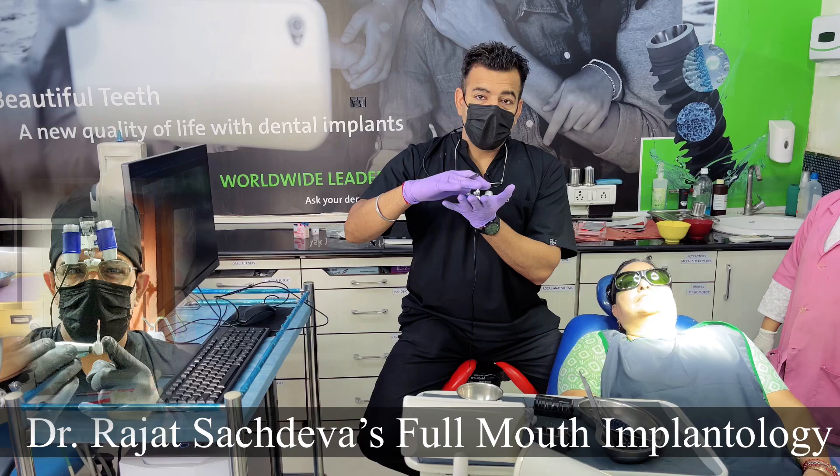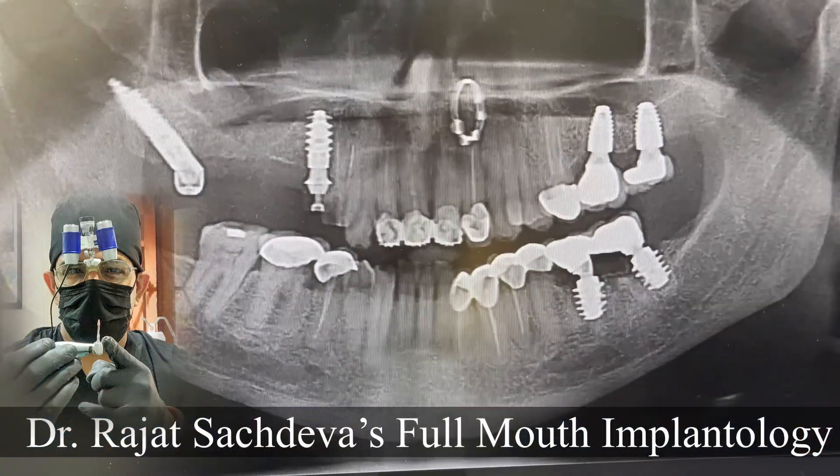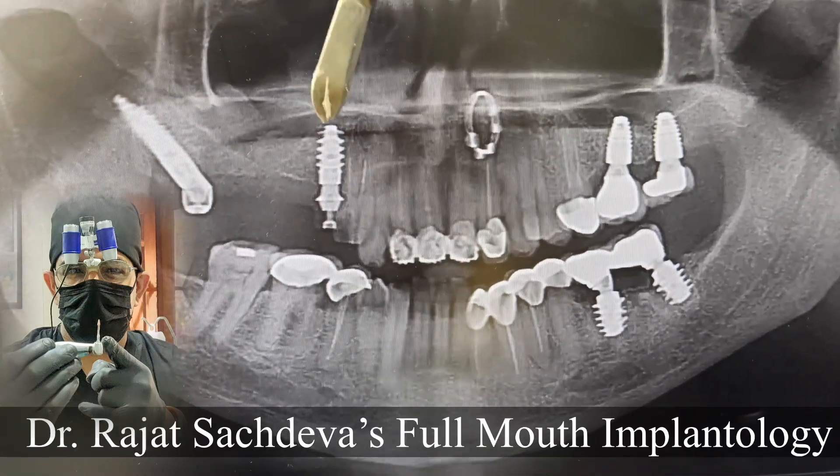You can also communicate with the lab. Now you can see that I have two implants placed here. This is a Pterygoid implant, and this is a BLX implant.